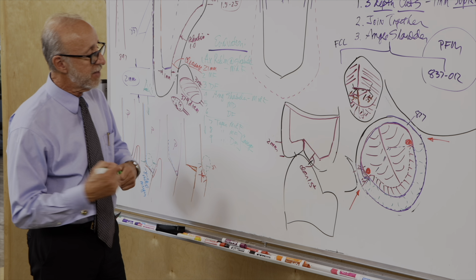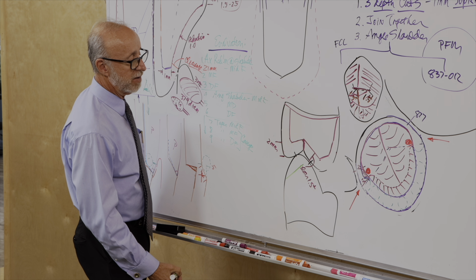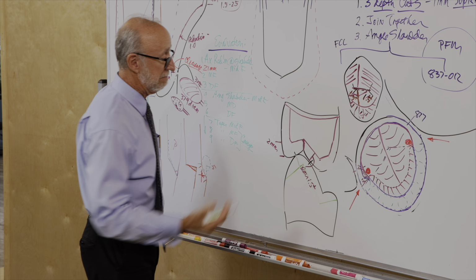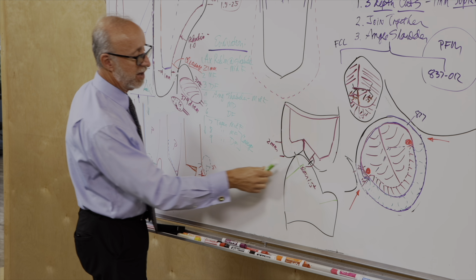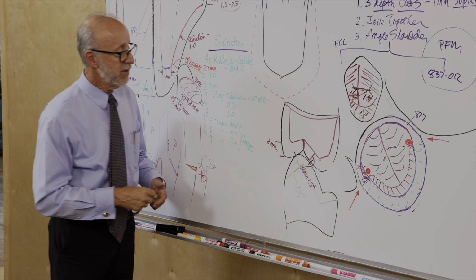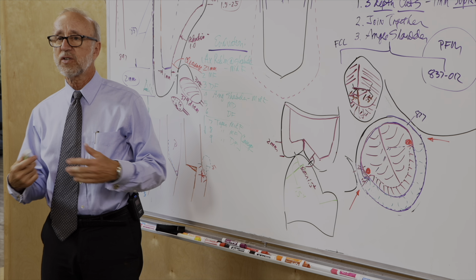Okay, and then on the lower arch, what we're looking for is clearance. For the A-plane, it's an A-plane. You know, that's what we've always been doing in the lower arch. Make that A-plane. Match the vertical angle to the opposing tooth, get the clearance that you want. In this case, 1.5 plus. You need to get enough clearance. We're not concerned about the aesthetics of the lower arch. Those teeth are covered with porcelain, so they look good.